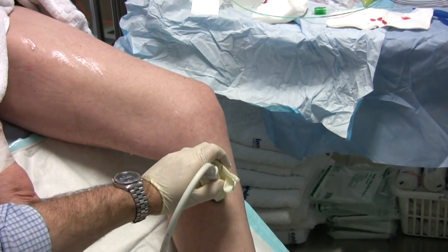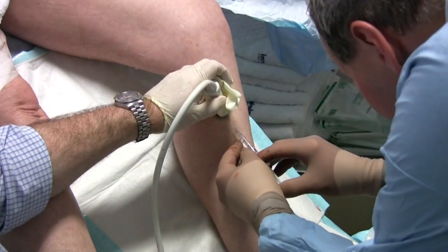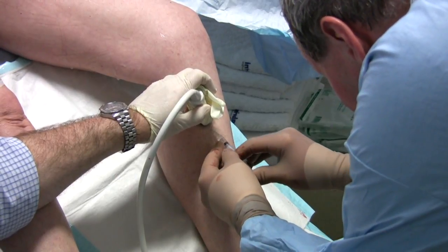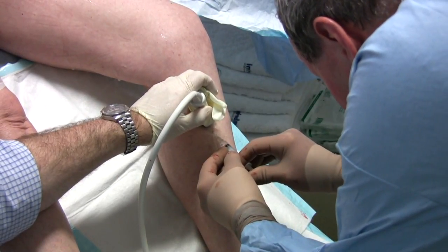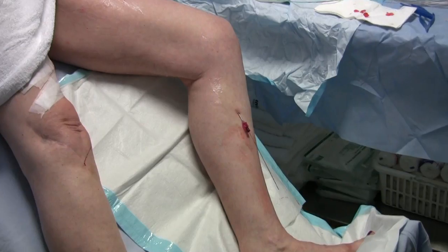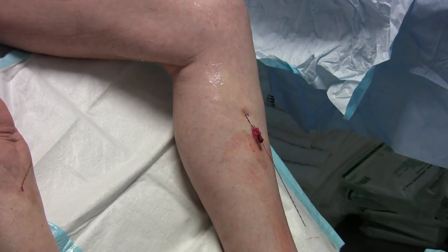Similar localization on the opposite limb is then performed to allow access with a similar access sheath. As you can see, the access needle with the wire guide extrudes from the vein at the access point.